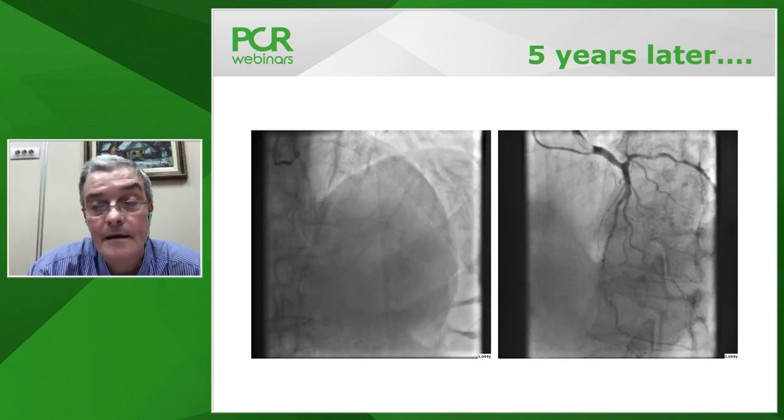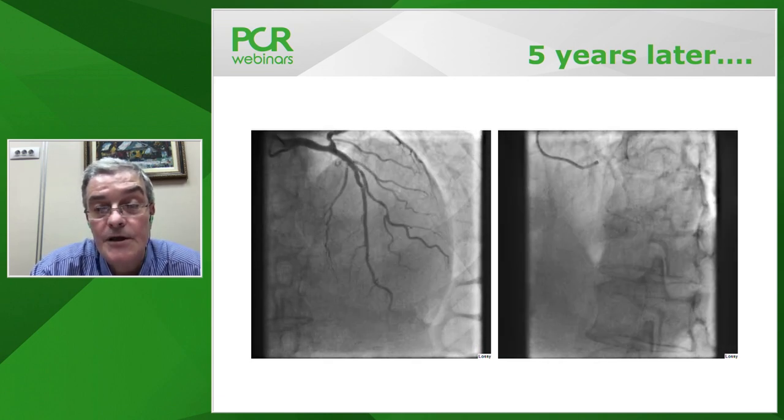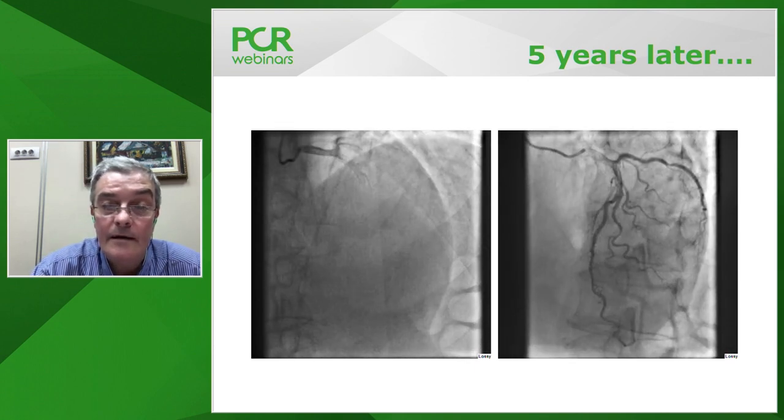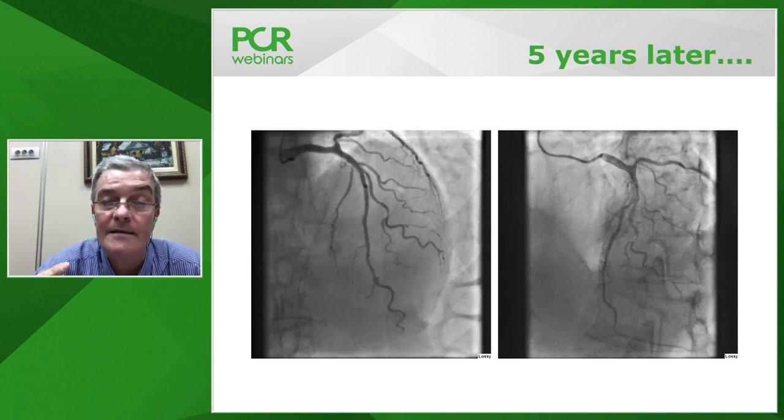I think it's great, and I really congratulate you on a fantastic result. One of the points that I think we should share is, if you are ready to accept an angiographically partially suboptimal result, but with TIMI flow and with residual stenosis less than 50%, all that we learned from prior studies is that provisional has very good long-term outcome if you finish the procedure with less than 50% and with TIMI flow. So these two are important, but of course it will always look nicer if you put a second stent. But nicer does not mean better clinical outcome and follow-up if you do angio.